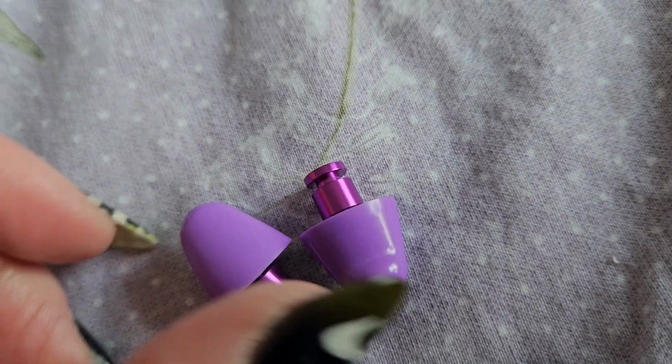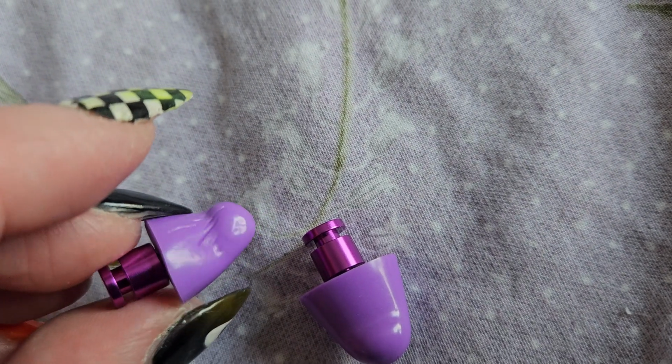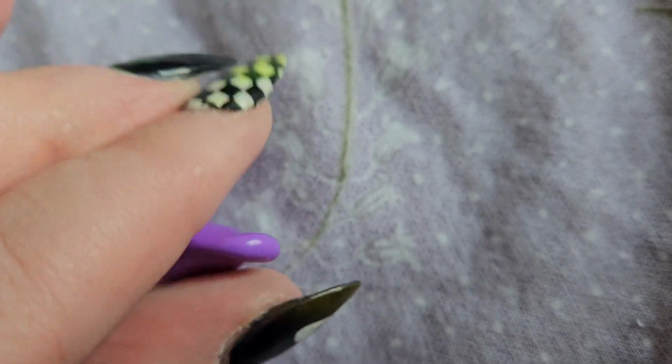These ones look completely different. They have a foamy kind of consistency, so they're really malleable and you can squeeze them and get them ready to go in your ear, and then you put them in your ear and they expand, and they are amazing at what they do. I don't use these ones as much because generally I want to hear things better. My sensory things are more like, I just want the volume to be down a little bit. I don't want to not hear anything. But if you wear noise cancelling headphones, then maybe these. So yeah, I prefer the other ones to the Ear Shade ones.